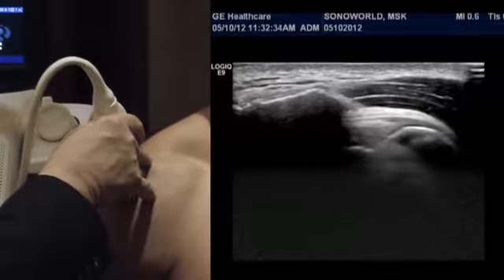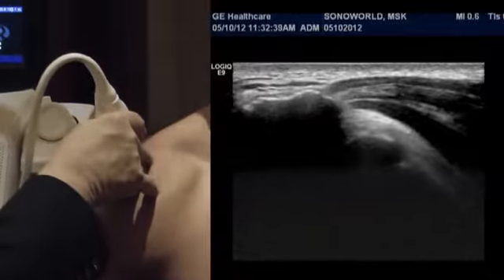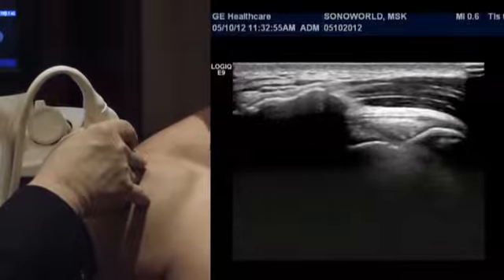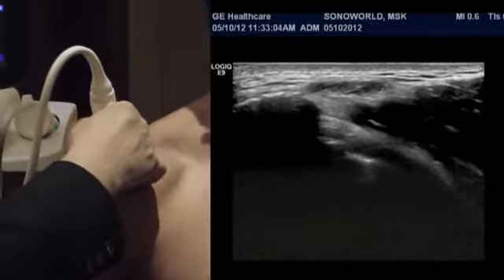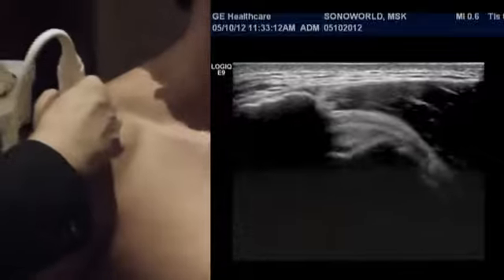An abnormal cogwheel translation will tell you that there is subacromial impingement. In addition, it all depends on where the abnormality might be. Right now, our model Mike is raising it at 45 degrees between the anterior and lateral planes of his body. If there was an abnormality in the anterior plane, then you may well move your transducer a little bit more anteriorly and then ask the model to raise his hand anteriorly in front of him, and this is how you'll try to catch the abnormality.